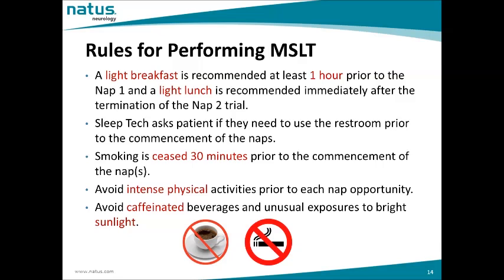So the sleep tech should ask the patient if they need to use the restroom prior to the commencement of the naps. Smoking is ceased 30 minutes prior to the commencement of the naps, and the patient is advised to avoid intense physical activities prior to each nap opportunity. The same applies to avoiding caffeinated beverages and unusual exposures to bright sunlight.